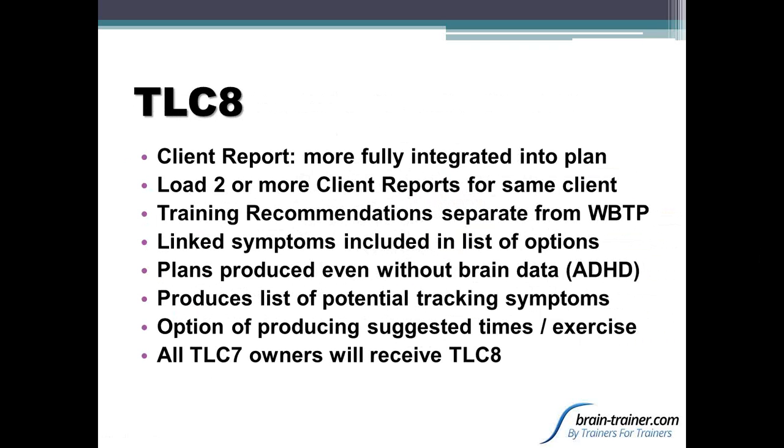So the idea will be with a more detailed client report, we'll be able to get you started with training. And what a lot of our people are doing now who are testing this is that they'll use that and they'll do 10 sessions of that, by which time most clients have settled down enough that then you can go ahead and run the TLC7 and gather the brain data and see if there's anything you want to add to what you're currently doing.